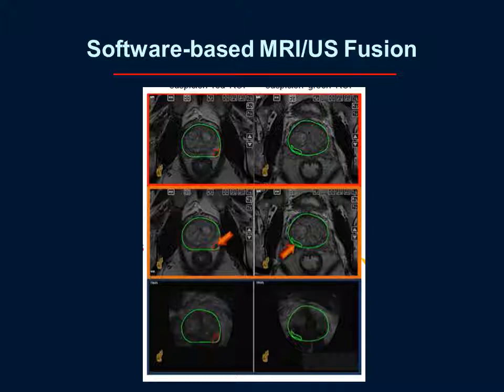The operator during the biopsy does an initial sweep of the prostate by ultrasound as well, and its boundaries get demarcated there, and then typically a combination of rigid and elastic registration are used to co-register the modalities and guide the biopsy to the MRI target.